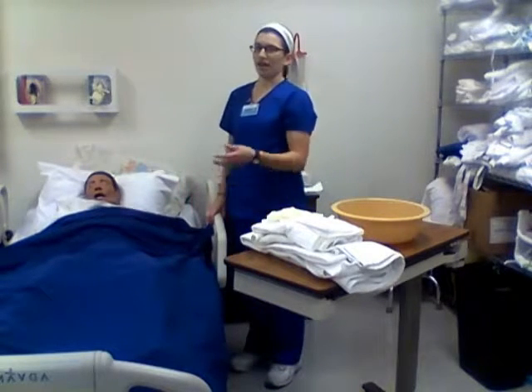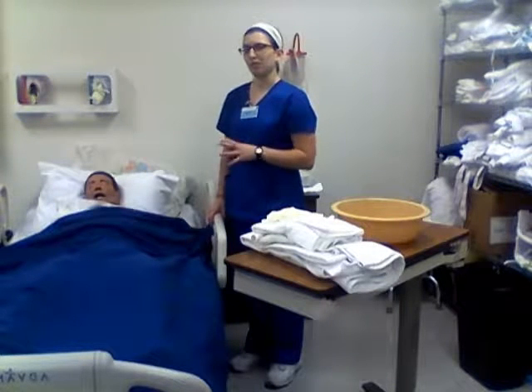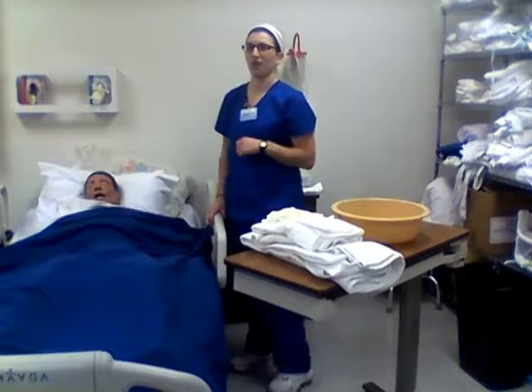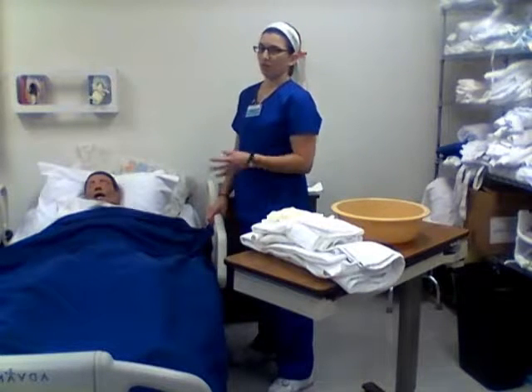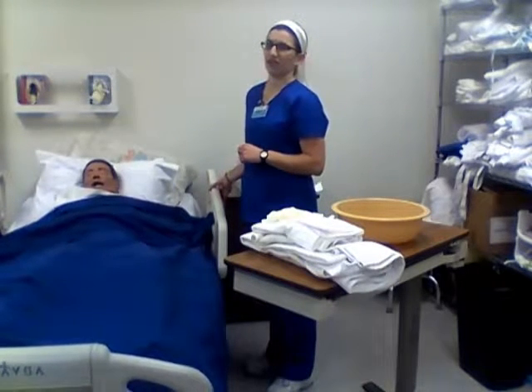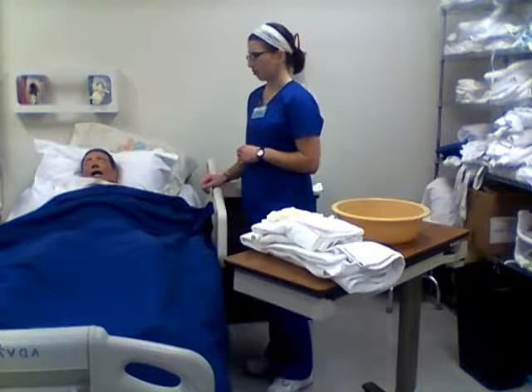So now I can go ahead, I can explain the procedure to the patient. So we're going to be putting in a urinary catheter to help relieve maybe some of her retention, or for whatever reason the healthcare provider had to put in a catheter. We're going to first raise her up because we're going to perform pericare first. And if she has any questions, I can explain those to her or help reassure her or anything that she wants me to do.